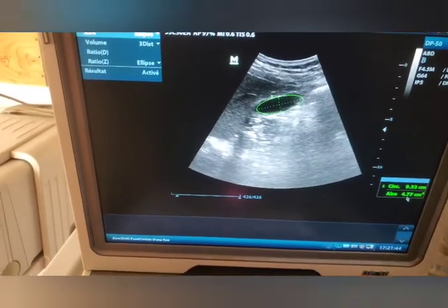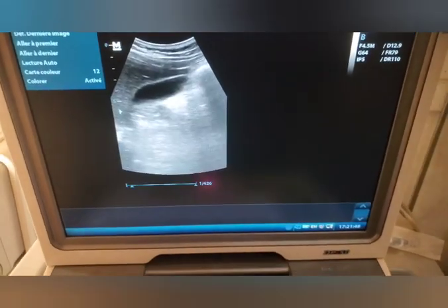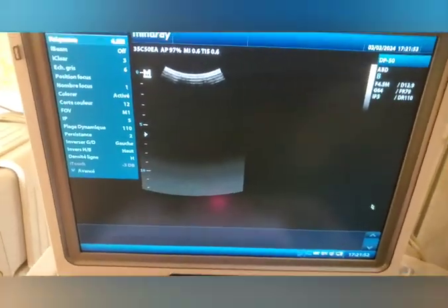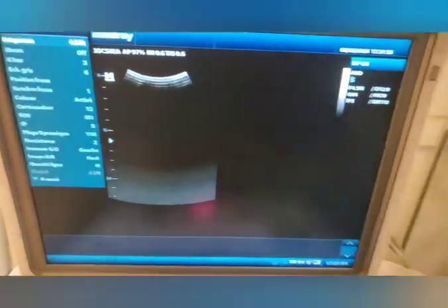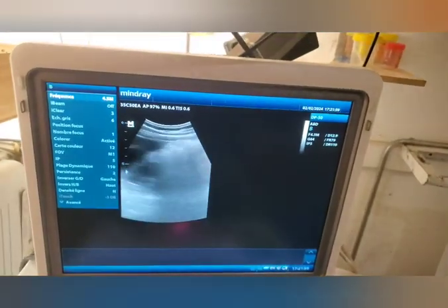Now what I will do is place a dual image. Is it clear? And then the next image I'm going to do. Is it clear? I unfreeze with a dual image. So this is my probe. I'm doing it on myself so that you can visualize it well.